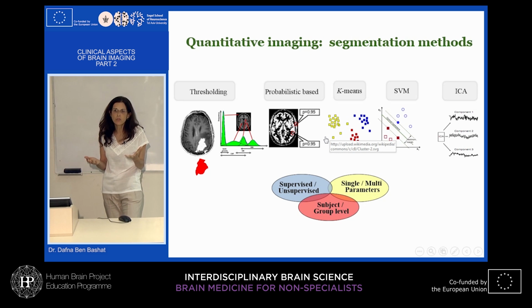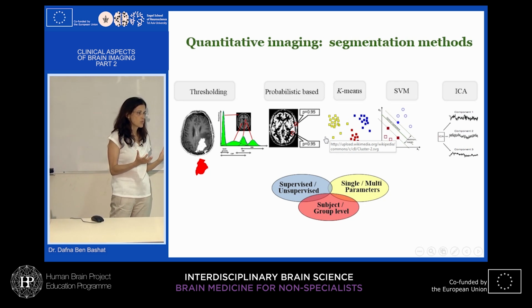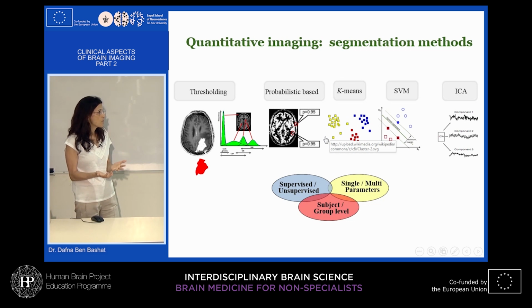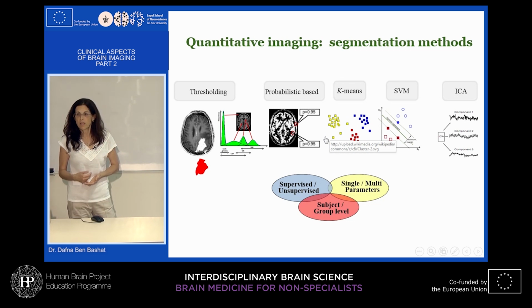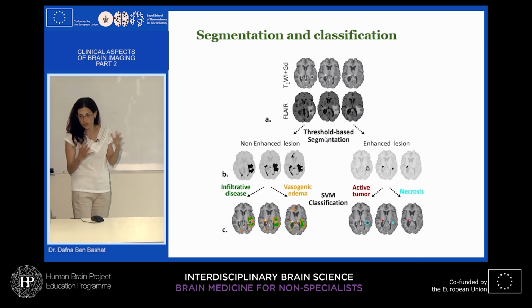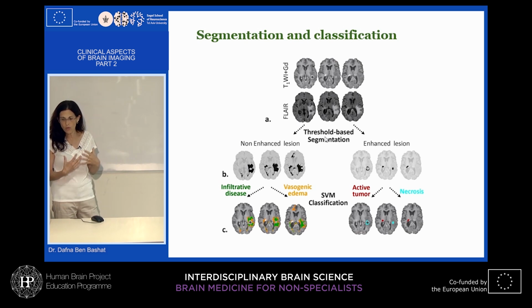So there's no meaning in saying this tumor has high vascularity. If I want to see small changes, I might need to look on a voxel basis. I might need to look at the histogram analysis. And there are a lot of approaches, not just ours but around the world, for how to segment and classify tissue.